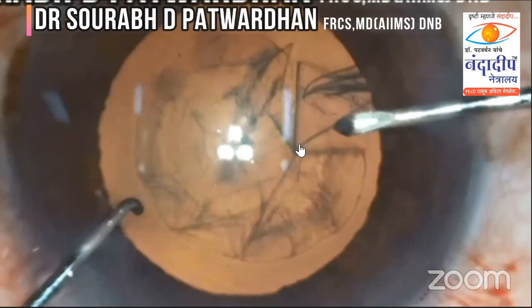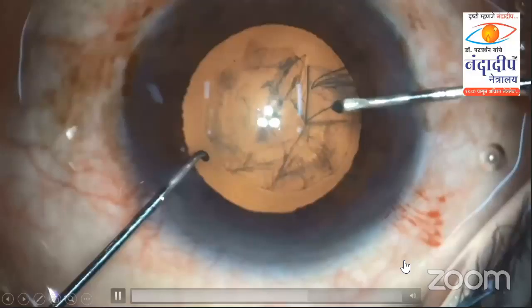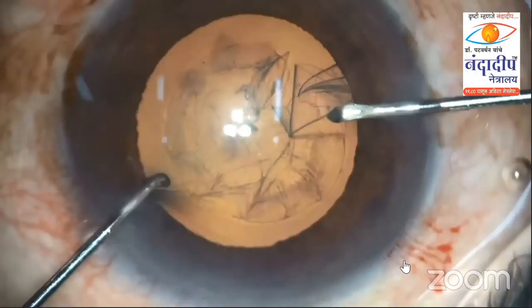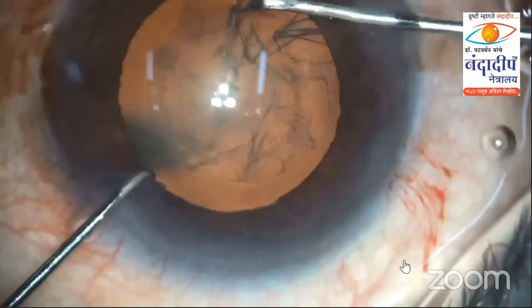This is the important area, because this is the part where many young surgeons tend to have extension of the CCC. So watch here, my 45-degree tip. I can visualize where it is holding the flap, and then I am proceeding further.